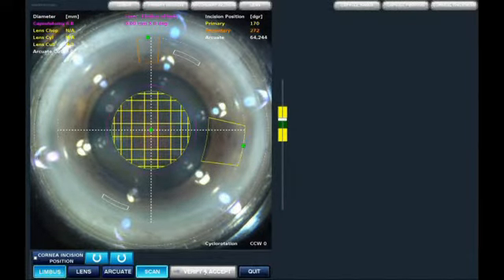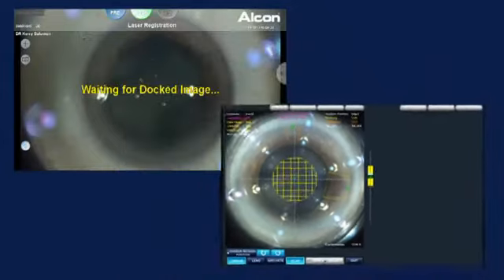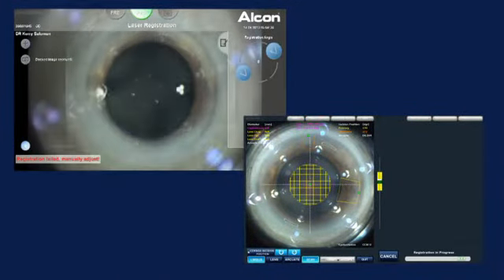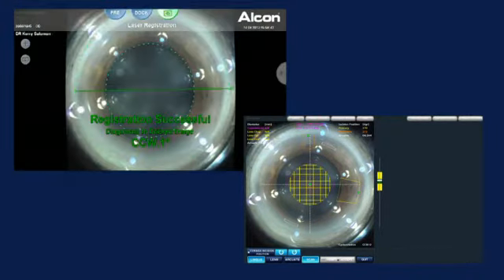Now we're going to go ahead and go to iris registration. We've engaged the guidance system and it's comparing the registered images once again using iris and scleral vessel registration, and we've aligned and we've got successful registration.